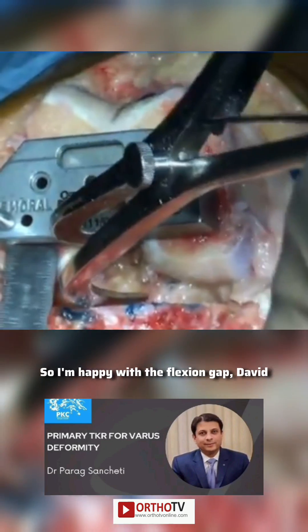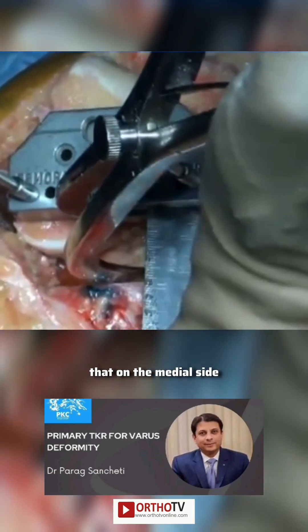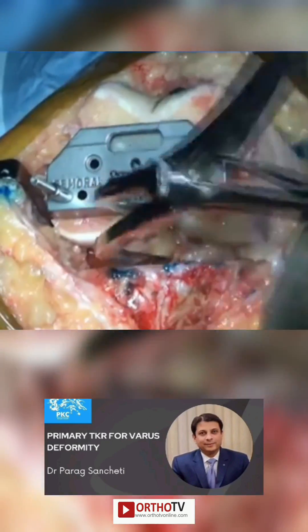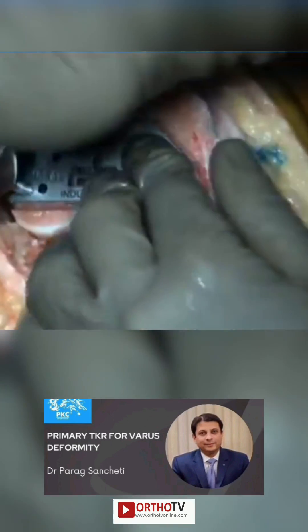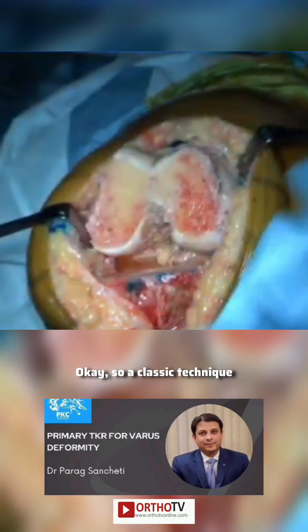This is about 20 and this is about 20, so I'm happy with the flexion gap. In case this was trapezoidal — which sometimes happens, where on the medial side you get it less and the lateral side is small — then I would need to rotate the femoral component. But here I'm going to go with a standard three-degree external rotation, aiming for equal flexion-extension and equal medial-lateral. Yes, a classic technique.